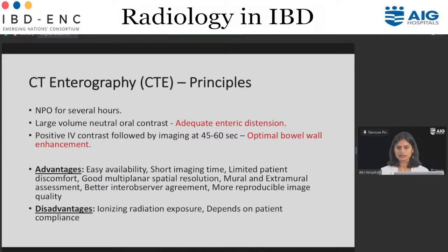Advantages of CT are that it's easily available, it's a short imaging time, and there's very limited patient discomfort due to its short imaging time. And we can look at multiplanar images. We'd also detect extramural inflammation without much difficulty, and it has an excellent inter-observer agreement. Disadvantages are primarily ionizing radiation exposure, and since these patients need multiple imaging studies, from a radiation standpoint, we would prefer MR enterography for follow-up.